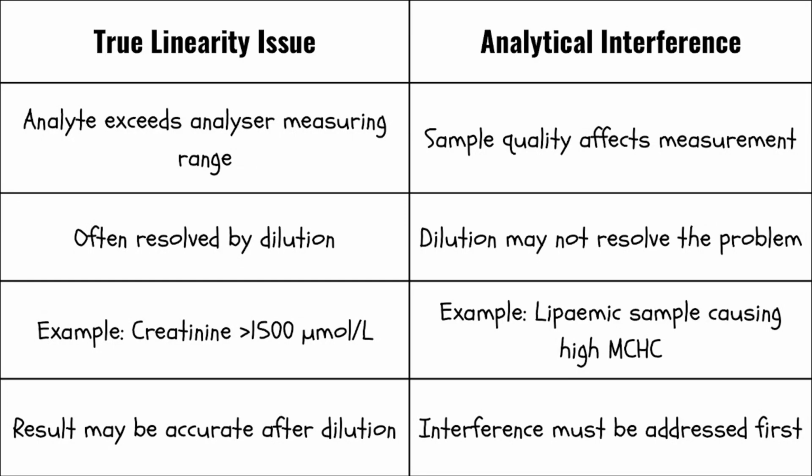Why? While you're diluting the lipid concentration, or the hemolysis, or the high bilirubin, you are also diluting the concentration of what you are looking for, which is wrong. So what you want to do in dilution is only dilute what you are looking for, okay? Not to dilute the quality of the sample. So that you dilute lipemic does not mean you are going to get a right result, because you are doing two things. You are trying to dilute lipemic, not the concentration of the analyte.